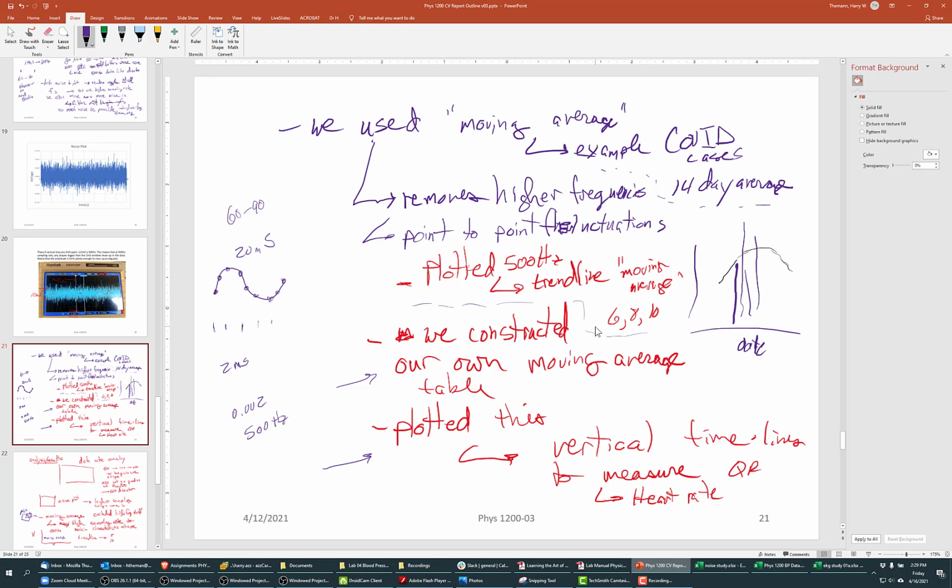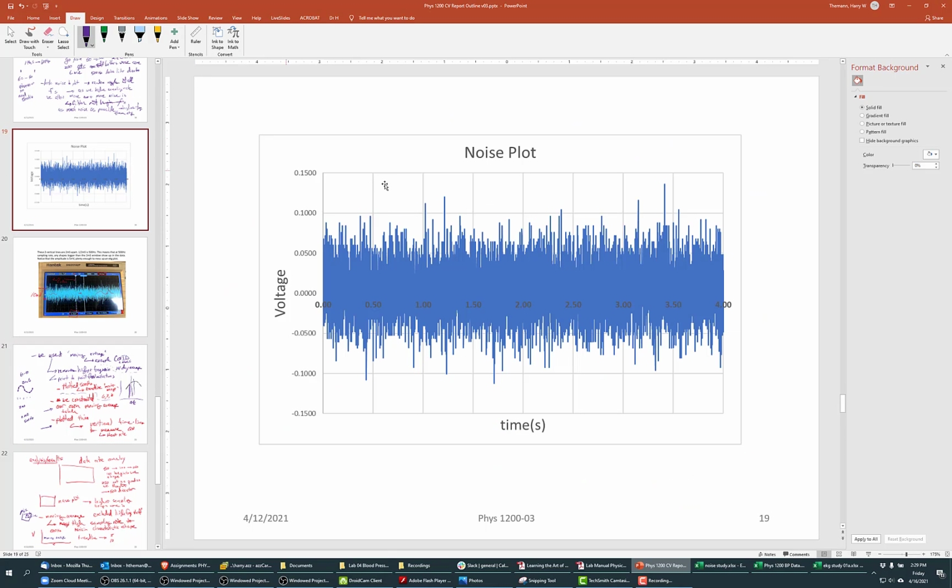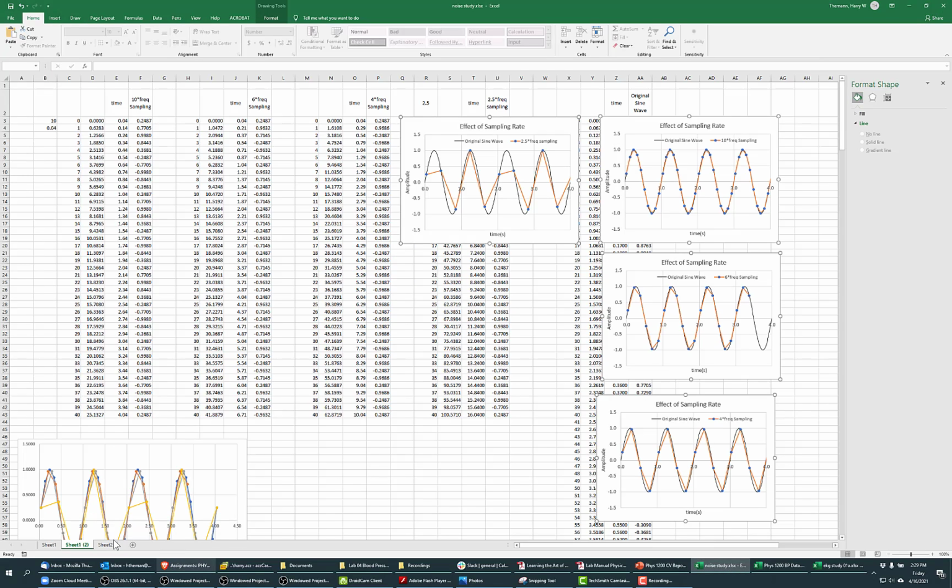And so 6, 8, or 10, and now we're not going into details about exactly what it's doing, other than it makes it look nicer. And for us, the explanation is it just gets rid of all these tiny wiggles. It's sort of like what I was doing here.